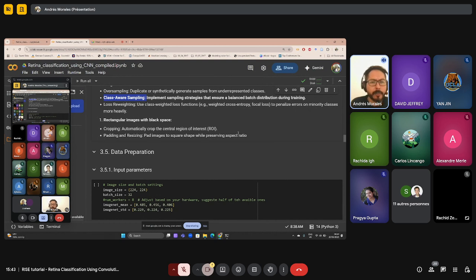One of the most important parts of the process when we set up this kind of model is the preparation of the data. Probably a lot of you have heard about "trash in, trash out", right? If you give trash to your model, you will probably get trash.